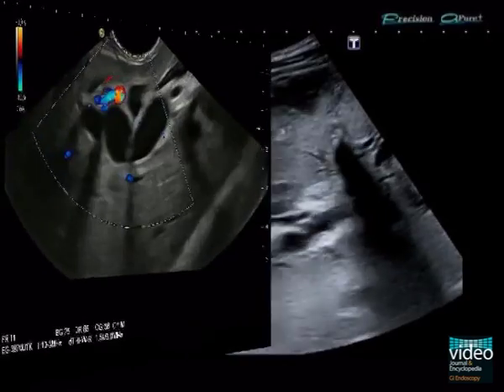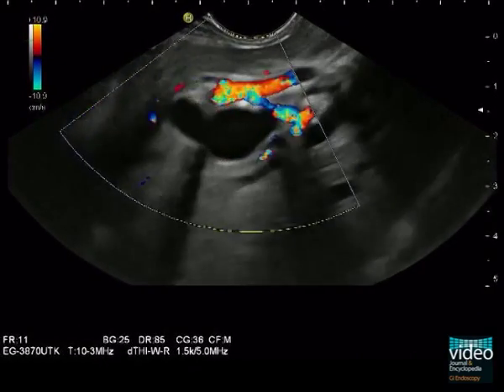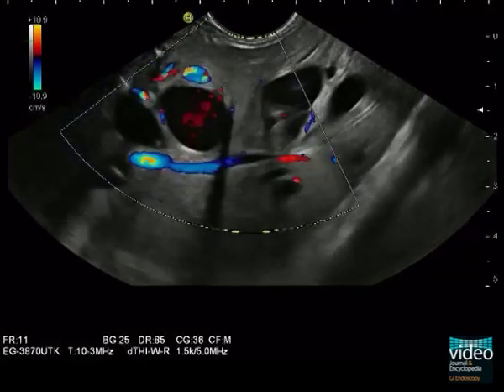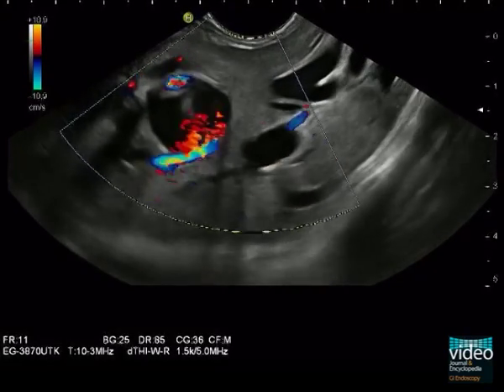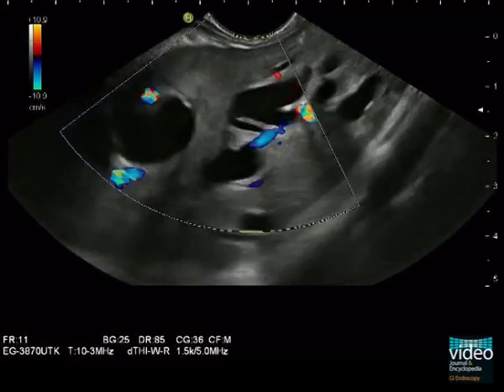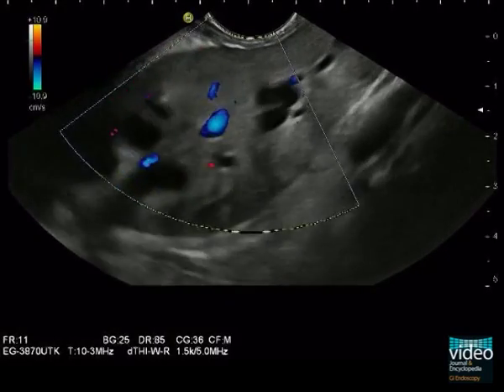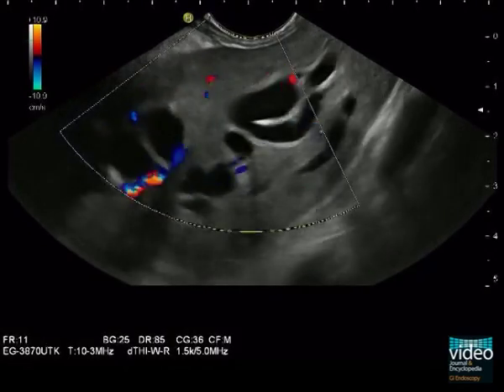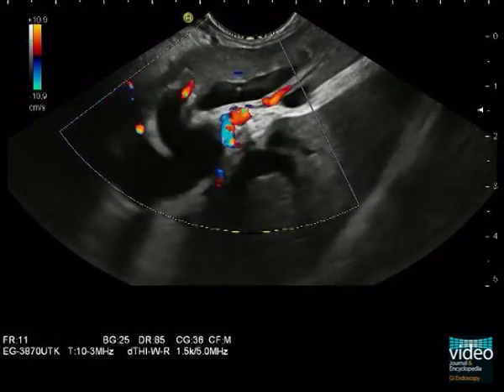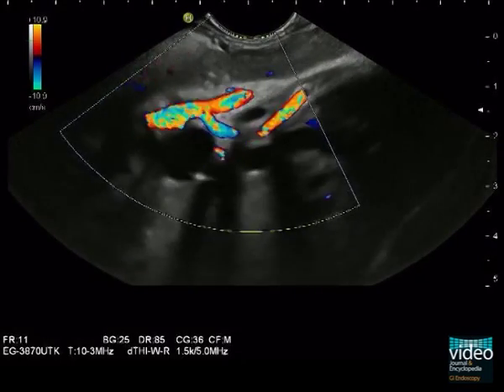The transgastric endoscopic ultrasonography of the left hepatic lobe shows the dilated intrahepatic bile ducts with undisturbed communication. Using color Doppler mode, many pronounced vessels near the bile ducts can be detected. The fundamental issue for planning of the EUS-guided hepaticogastrostomy is first searching for the best and safest site of an interventional approach to get access to the biliary system.